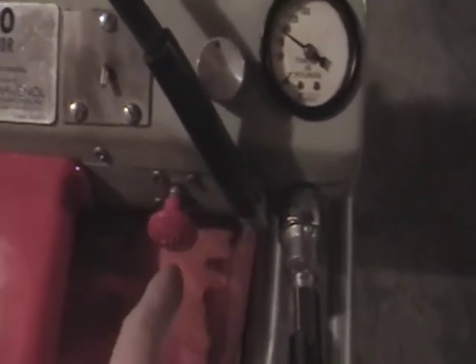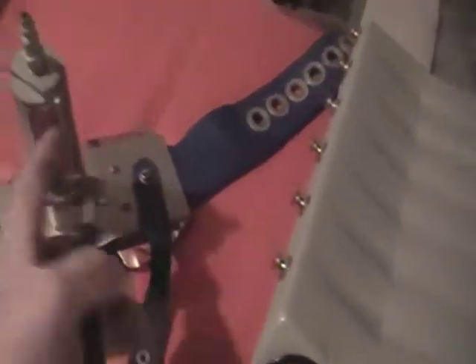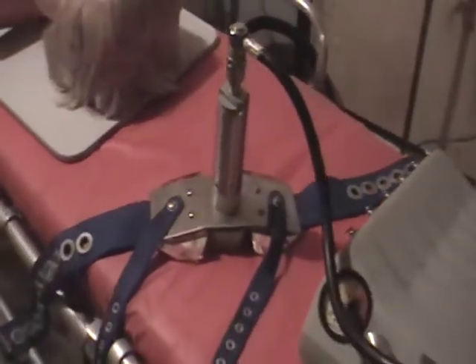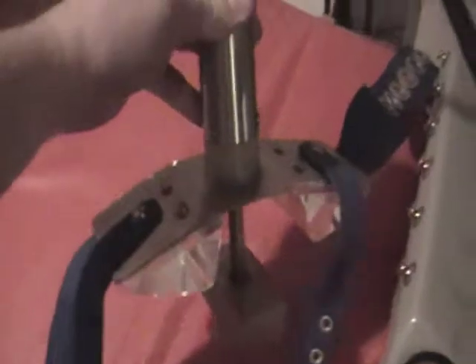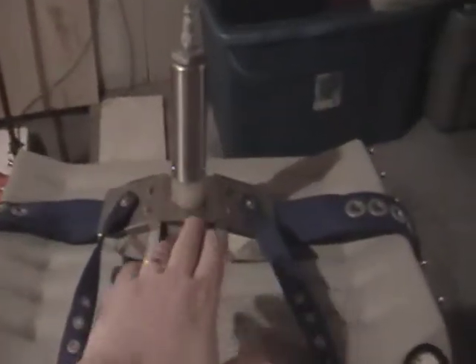This is your on/off switch — pull on it for it to work and push on it to stop it. From inside the machine, the air comes out into this hose and hooks onto the top of this cylinder right here. When we turn the machine on by pulling on the knob, the cylinder goes in and out.